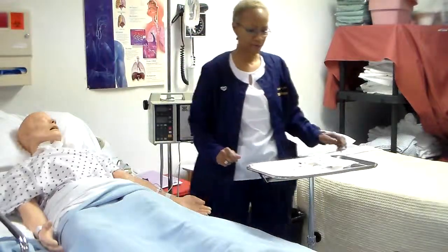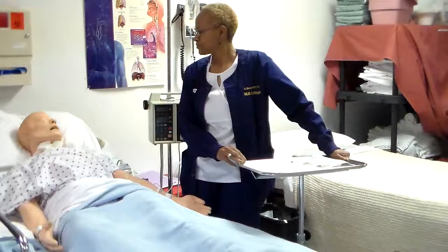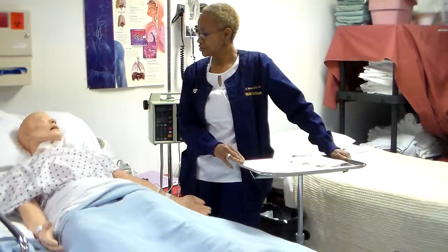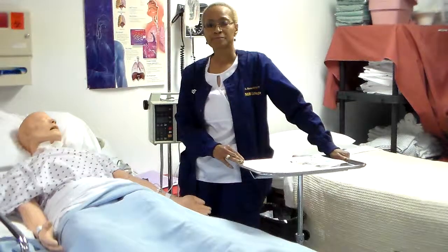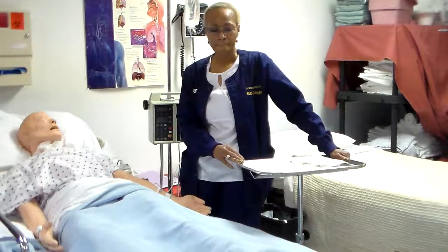Wonderful. Now, Mr. Johnson, do you know what this medication is for? Okay, it's for the infection that you have? Great. Encourage client to report symptoms of discomfort at site. Verify medication. Third check.